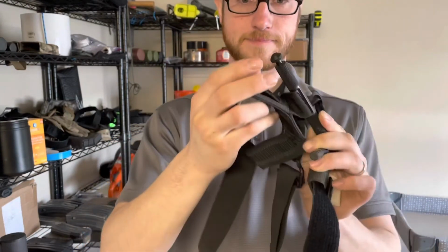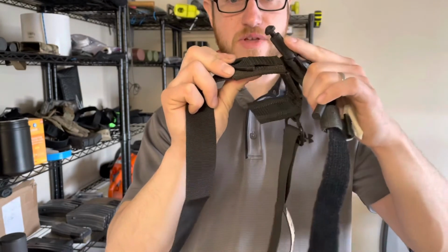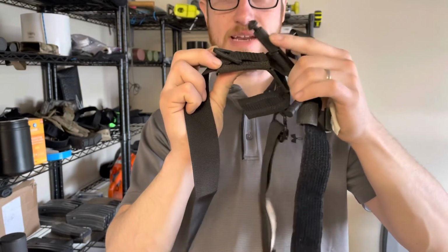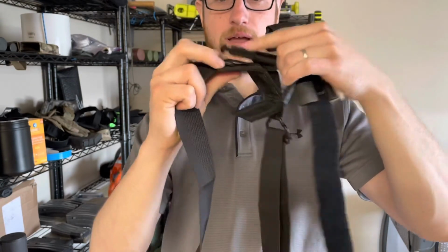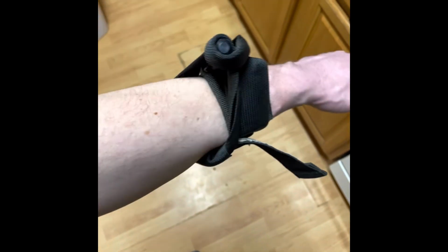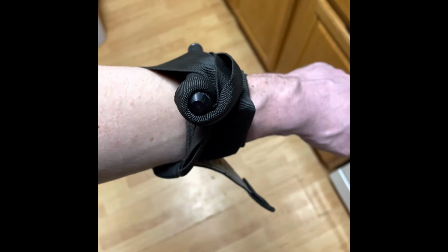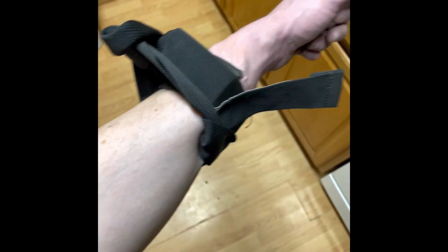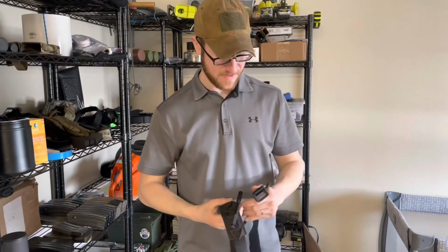Windlass goes in like this and clips. Well, when this goes around the arm, it's much harder to get this down one-handed to the triangle securement ring. So what I did was, well, you'll see in the video. On this episode of figuring out how to do a one-handed SOFT-T Wide without being able to use the triangle, and it was in fact able to be done one-handed. Pretty neat. It worked, so yay for that.